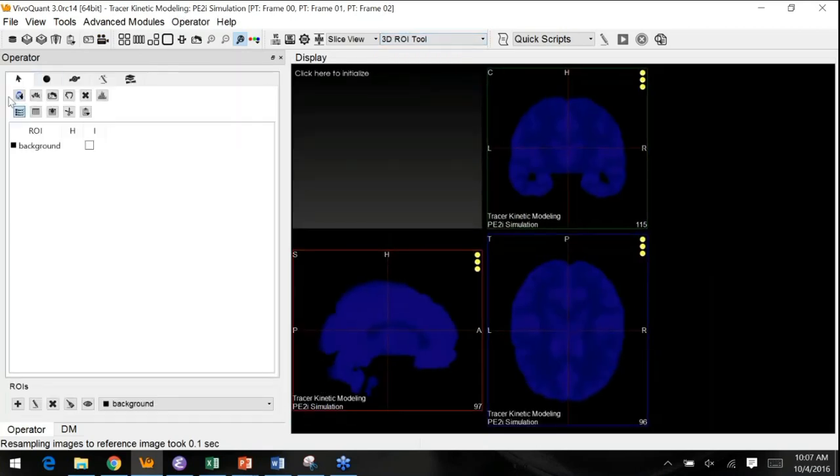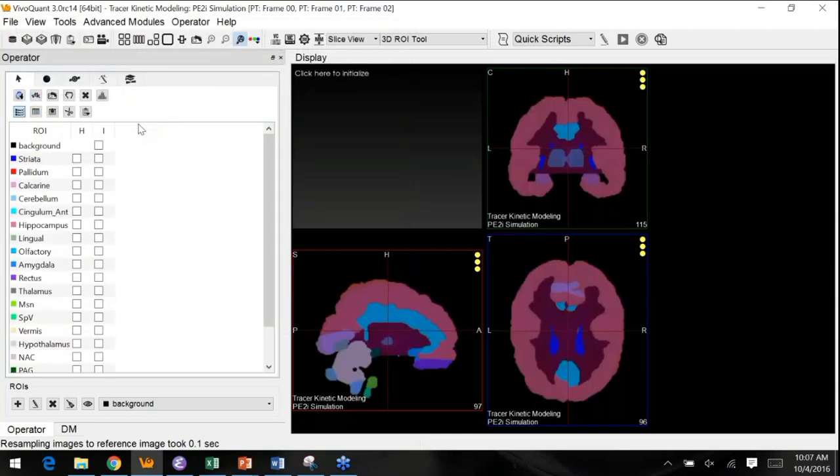So going into the 3D ROI tool, I'll load an ROI directly from the computer. Again, all of this workflow could be fully integrated with the IPACS. These ROIs can be stored to the IPACS, as many of you know. The data could have come from an IPACS. To be honest, the only reason I didn't use the IPACS was because I wasn't too sure what the Wi-Fi situation would be like today. So far, it's been good, though. So good for the people on the call.